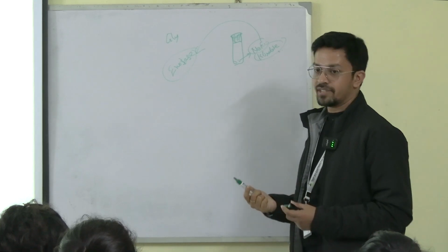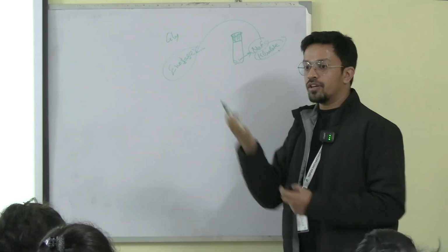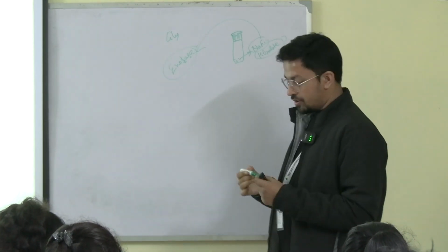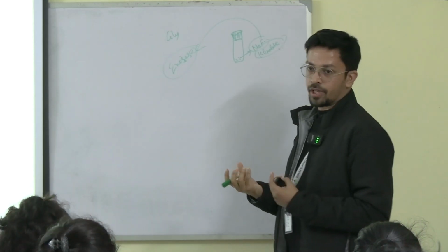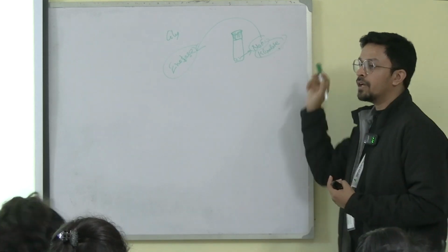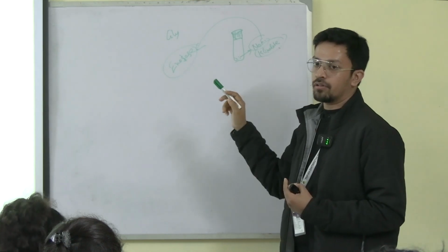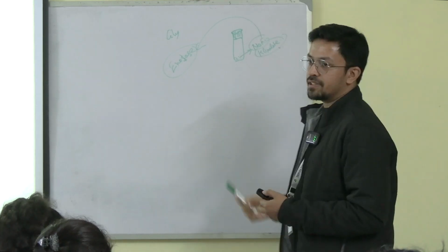What will happen if the glycolysis is happening? The glucose value will be less, because the glucose is already getting broken down, right? So to avoid that, you are giving sodium fluoride in the vial already. These chemicals are already built in. The sodium fluoride helps inhibit the glycolysis at the enolase enzyme step, and the potassium oxalate acts as an anticoagulant. Any doubt? So these two are present in the gray vacuum container.